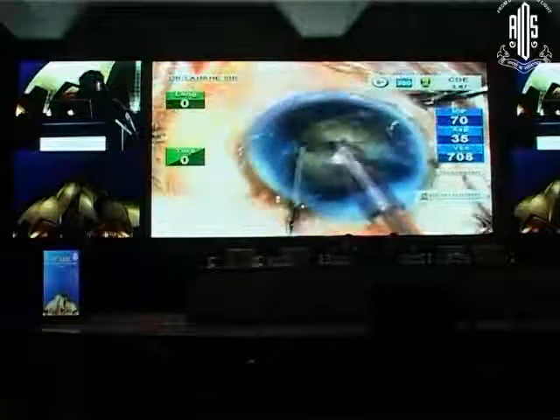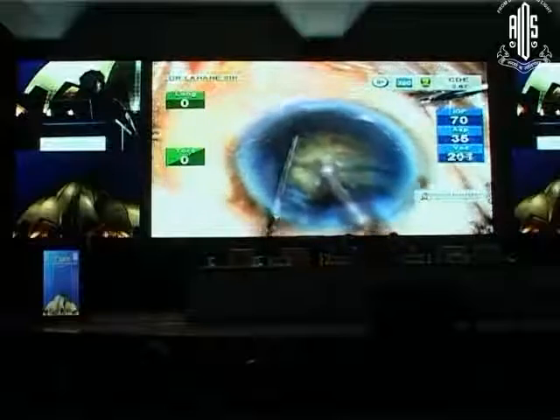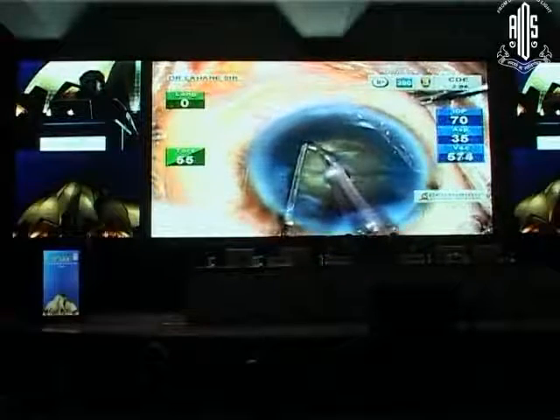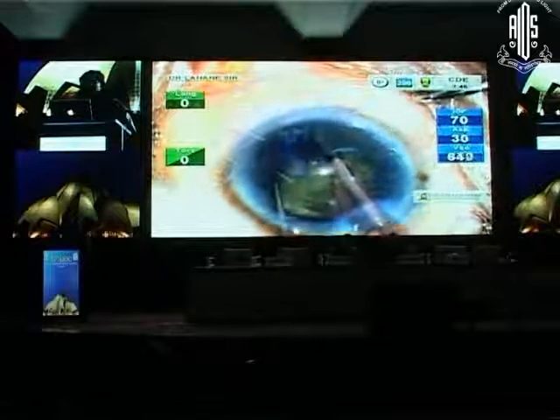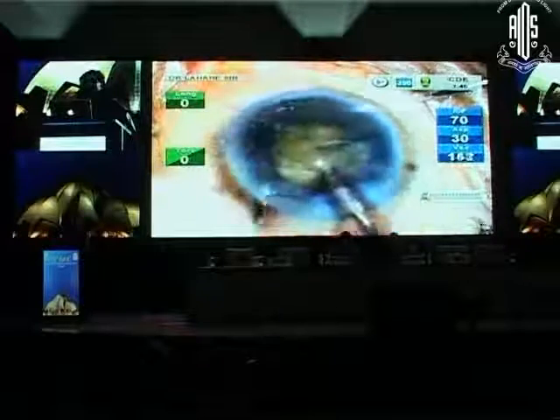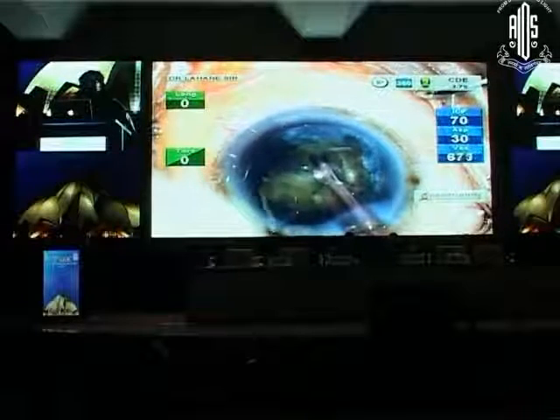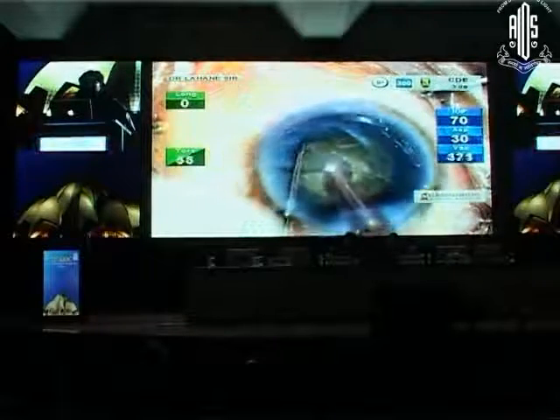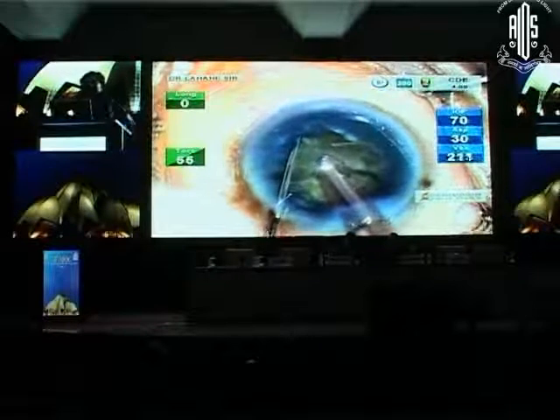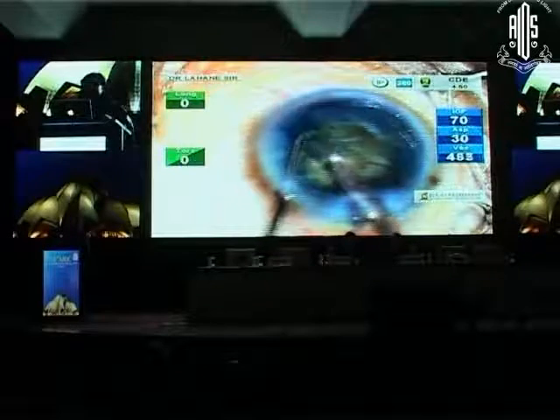After you get a hold, the chopper is used to divide the nuclear substance into straight 2 pieces, which is the first division. Now again the phaco tip is embedded and the chopper is used to separate more pieces and create more pieces so that smaller pieces can be easily occluded, emulsified by the phaco and aspirated. The chopper is used to rotate the nucleus, to keep the pieces from banging into each other, and the chopper is also used to create the small pieces by chopping the nucleus substance mechanically.